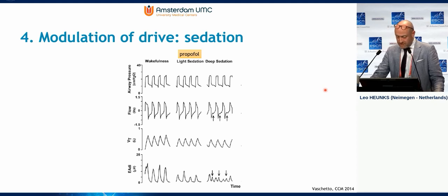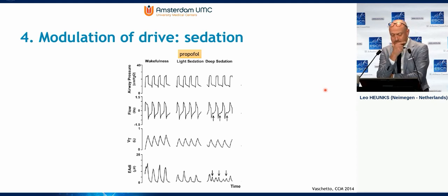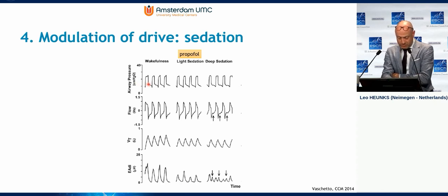So this is a nice study by the group of Paulo Navalesi, published a few years ago, patients on pressure support, so level of support, flow, and electrical activity of the diaphragm, with increasing levels of sedation. And as you can see here, increasing sedation decreases the amplitude of the EDI signal, decreases the respiratory drive. So that might be a good option.